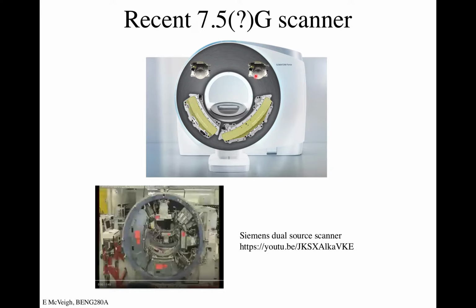The other thing you can do is you can make two different pictures. You can make X-rays of a different energy. Say this is 70 kV, this is 140 kV, so you get two separate pictures. And they're X-rays of the same object, but taken with different energy X-rays.